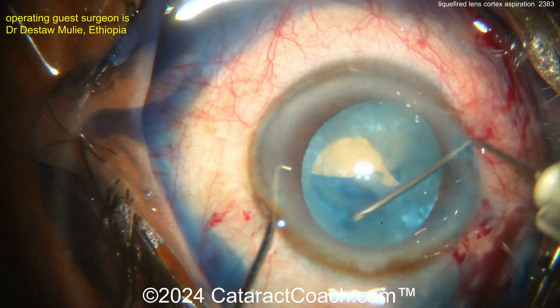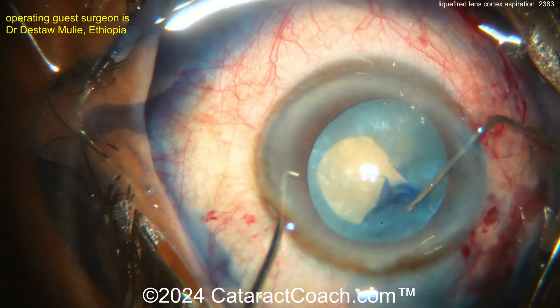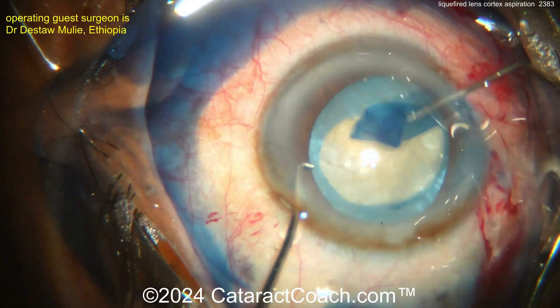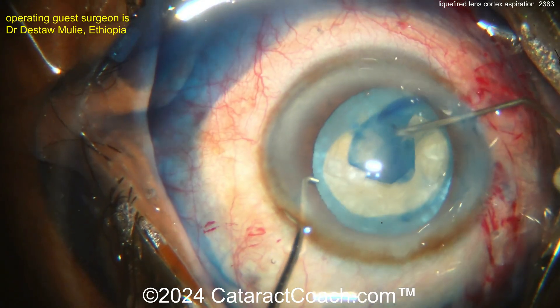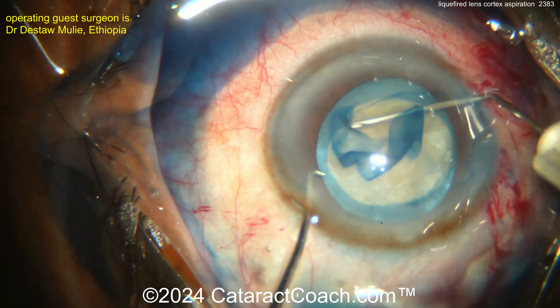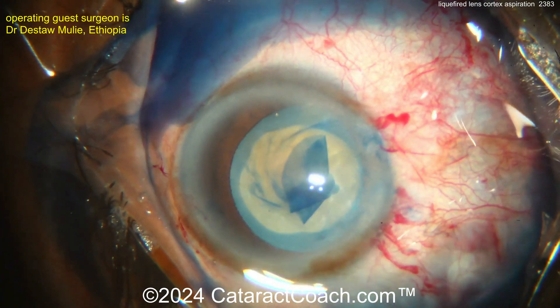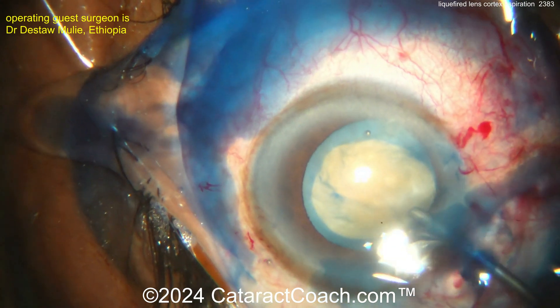You have a lot more control at this point because you don't have that pressure from the liquefied lens cortex pushing anteriorly. If that pushes the nucleus up towards the anterior lens capsule, it can induce the Argentine flag sign. Looking good — nice capsular rhexis here, and again I can never get enough of white cataracts.